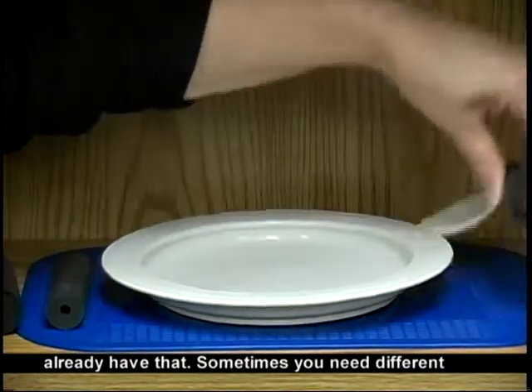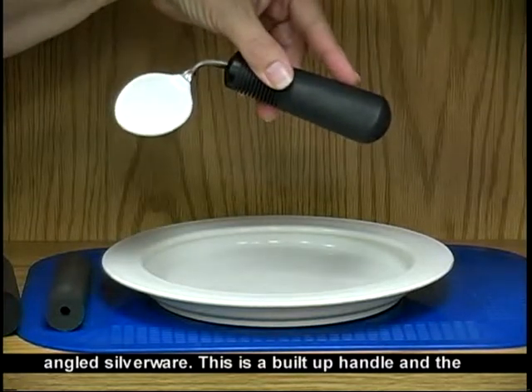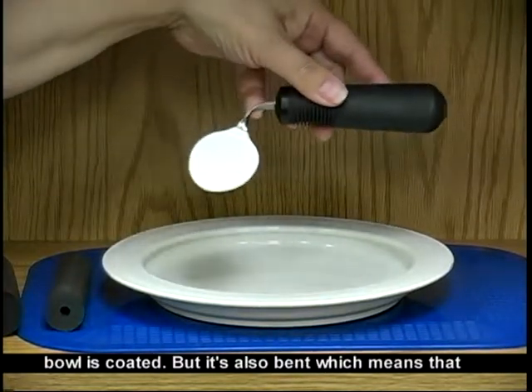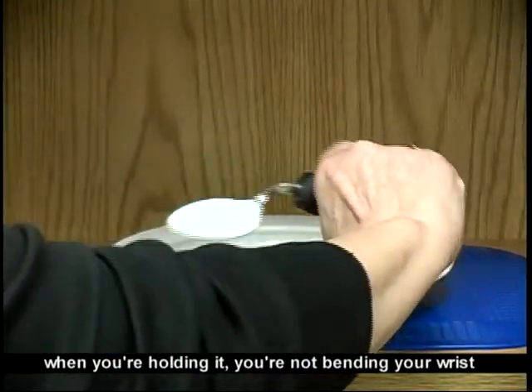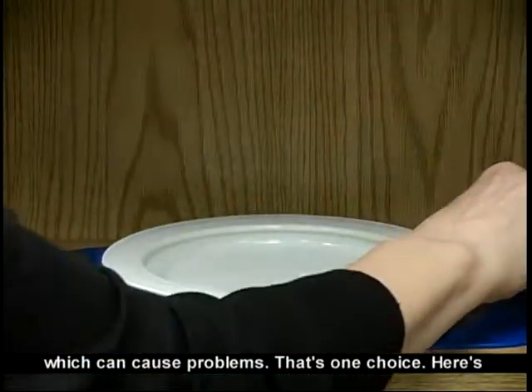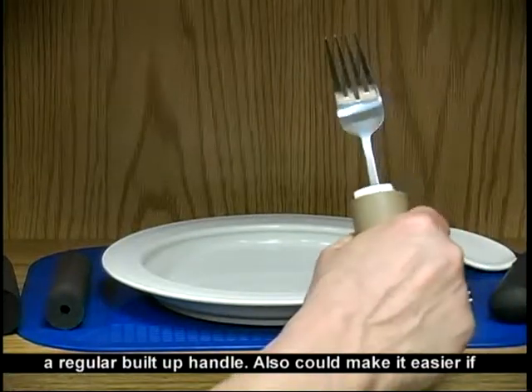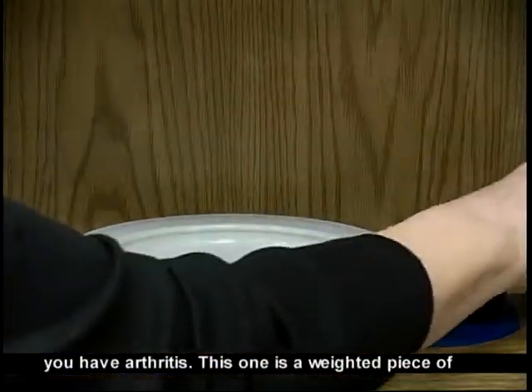Sometimes you need different angled silverware. This is a built-up handle, and the bowl is coated, but it's also bent, which means that when you're holding it, you're not bending your wrist, which can cause problems. That's one choice. Here's a regular built-up handle. Also could make it easier if you have arthritis.